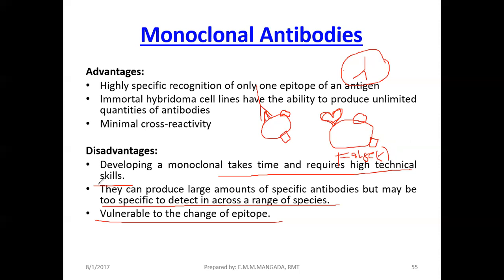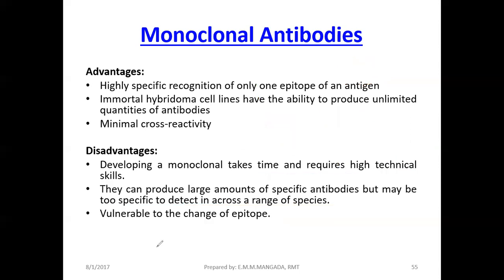So if you can see guys, yung disadvantage ni monoclonal are actually the advantages of polyclonal. And the advantage of monoclonal are actually the disadvantages naman of polyclonal. Okay? Antibodies. So that's your monoclonal versus your polyclonal. So guys, if you have questions, feel free to raise them in the forum discussion. Okay, I'll be answering them.